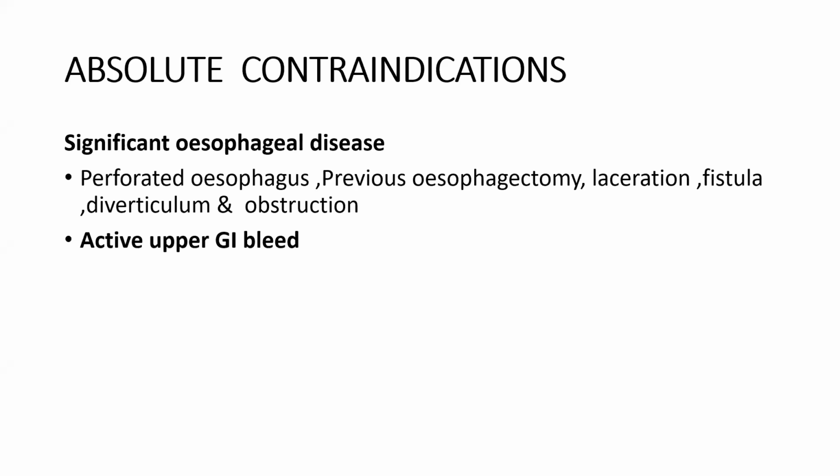If it's not going smoothly, abort the procedure, and you can refer him for endoscopy to see what is the cause of the resistance. Of course, you have to give him good sedation before you make this decision.